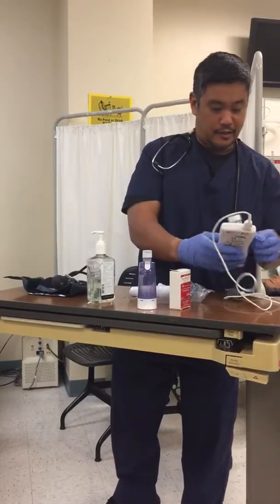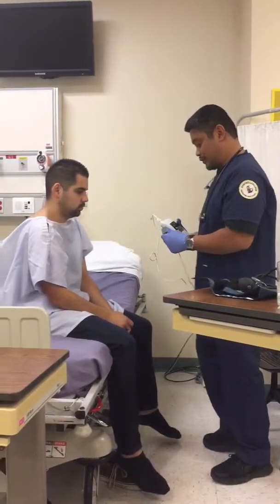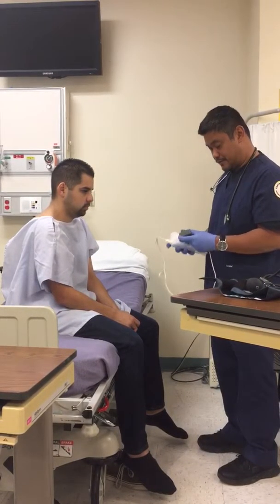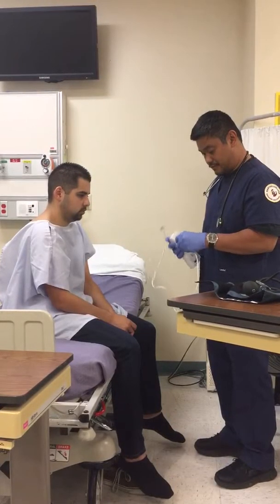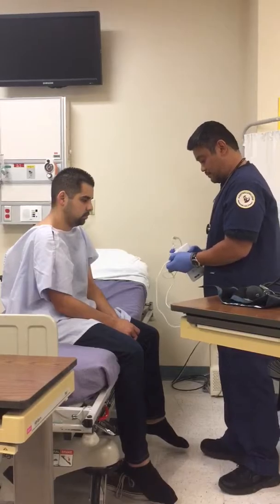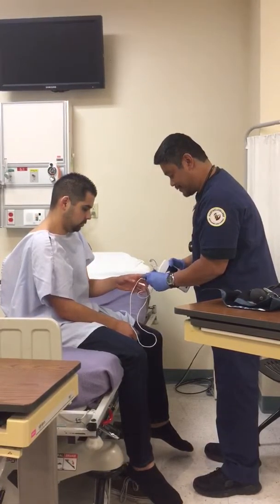All right, and we'll be taking your oxygen saturation level here. It's called a pulse ox. So go ahead and put this on your finger. Sorry, not too used to this particular one. Go ahead and put it in there. Okay.